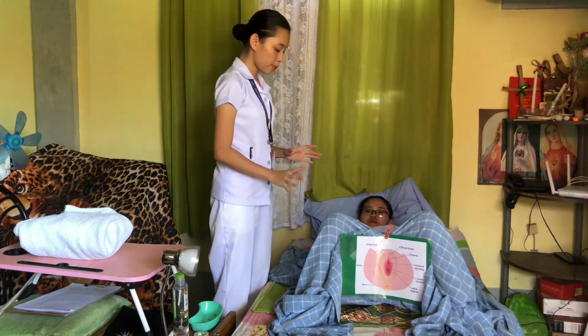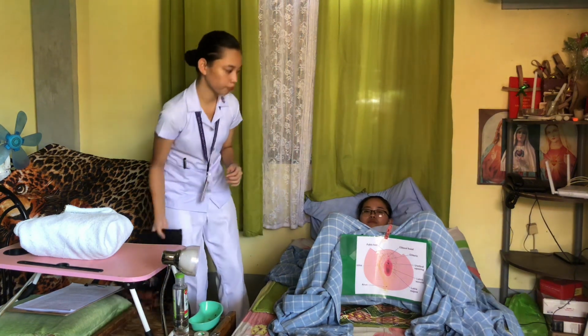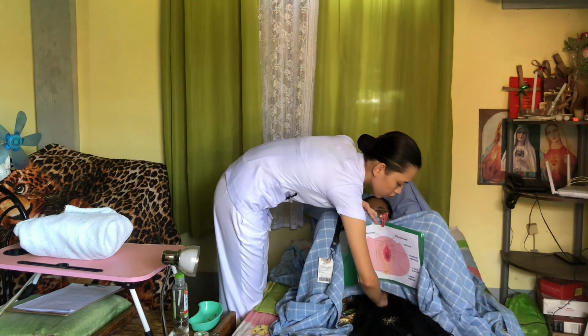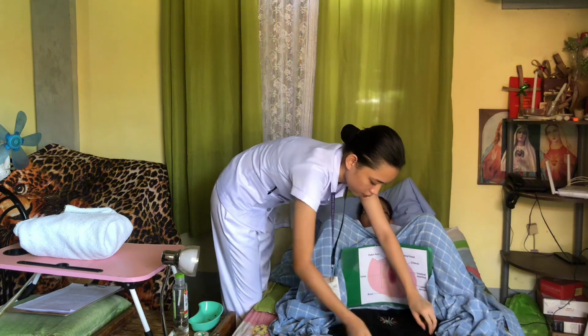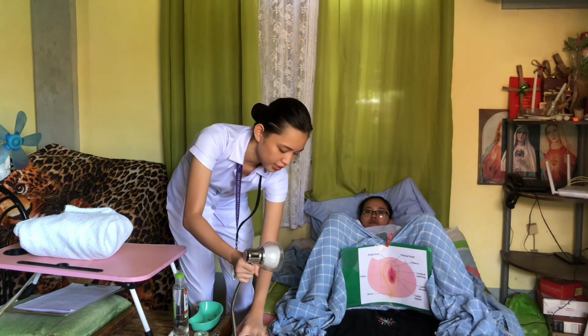So after that, ma'am, I'm going to place an underpad so that we can protect the bed from becoming soaked, okay? So can you lift your buttocks for me, ma'am? Alright, now that we're done, we're going to provide a direct light for the visualization of the genital area.